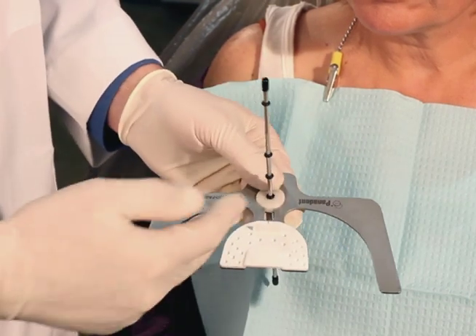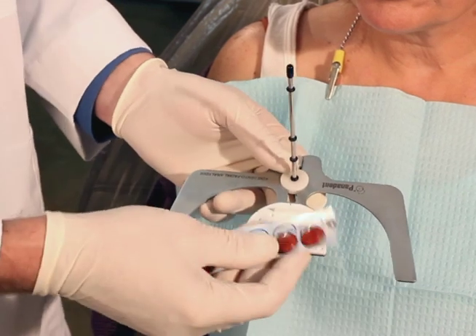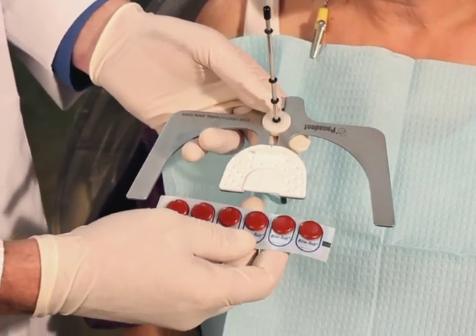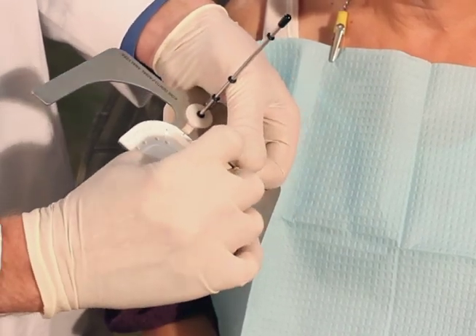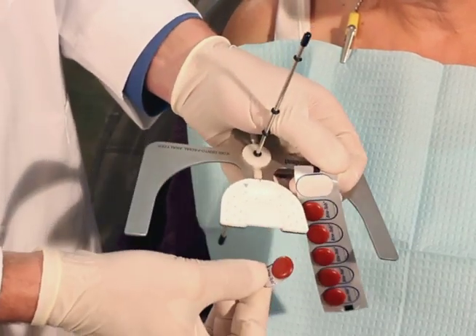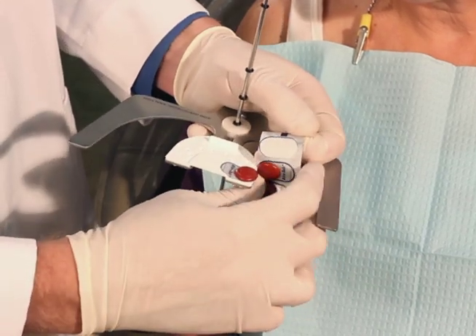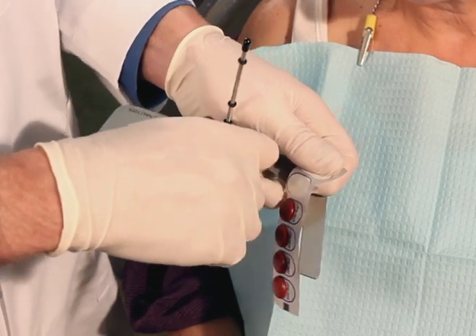At this point you can use either a bite registration material, wax, or you can use the Panadent Bite Tab. It's a red impression compound that's been put on a self-adhesive strip. We can peel this back on one side and peel off the whole strip including the compound, then stick them on both the molar areas.